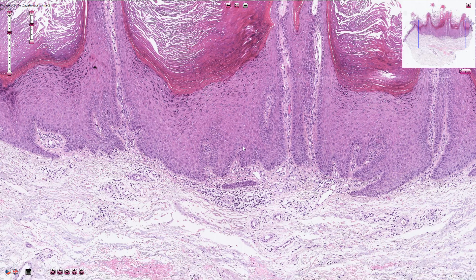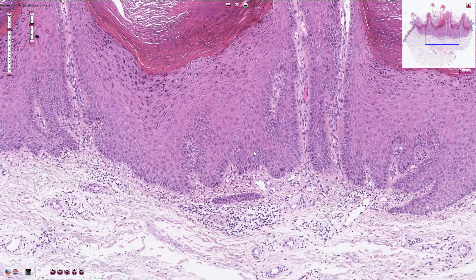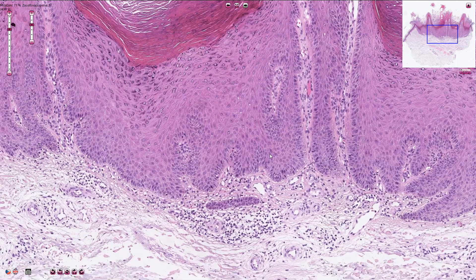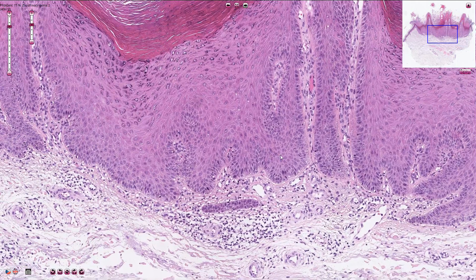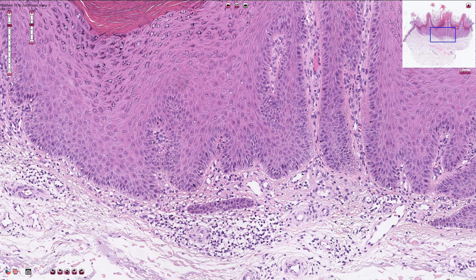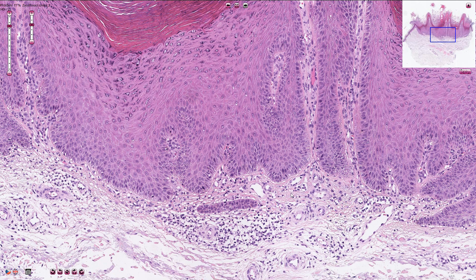Keratinocytes are usually bland; we do not see any cytomorphological atypia. The mitotic activity is quite low and is seen mostly in the basal layer of the epidermis. The inflammatory component can be sparse, or sometimes also quite prominent, especially if the lesion is irritated.